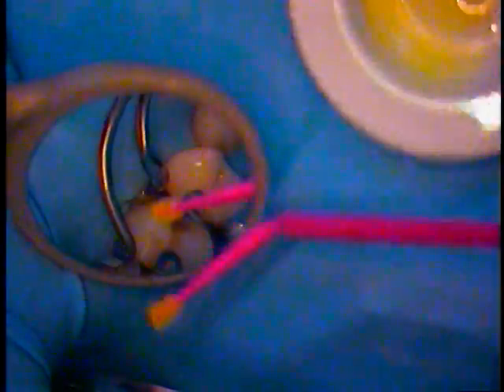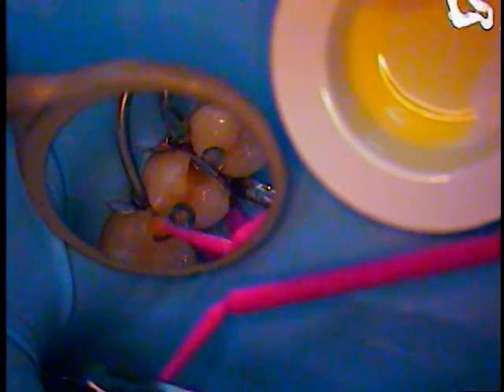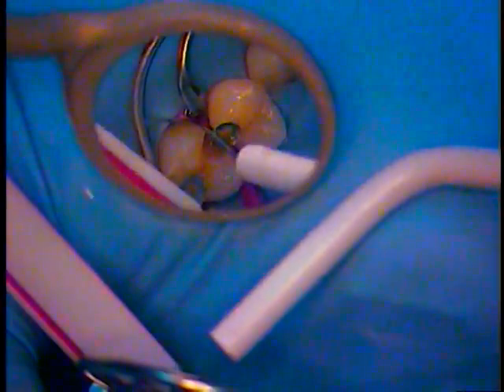We'll use the adhesive first. That needs to be scrubbed more. I'm really dragging it up in the buccal and lingual walls. Here comes the air — it just prevents pooling.